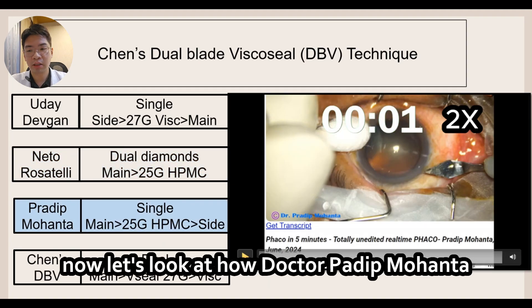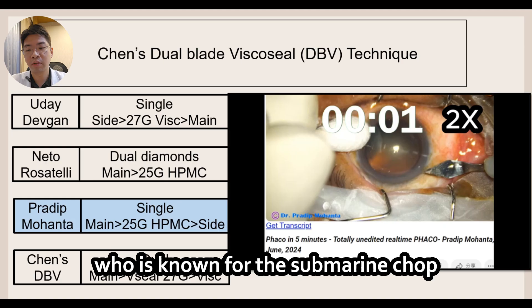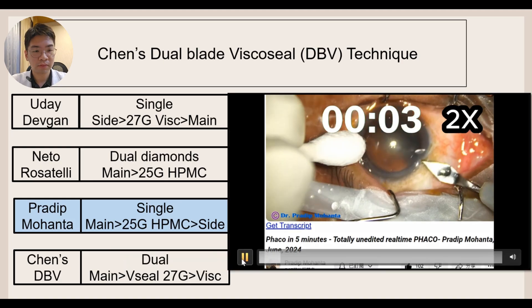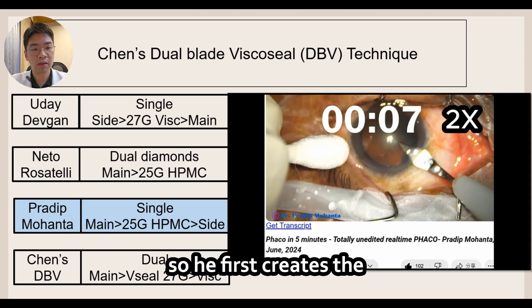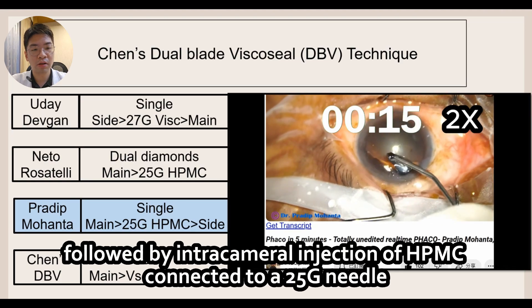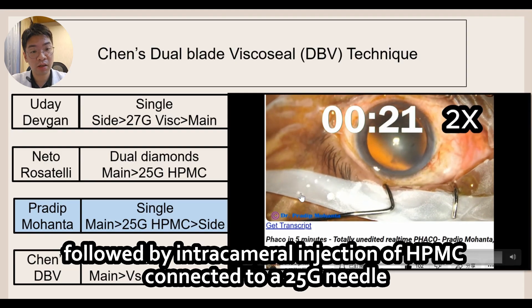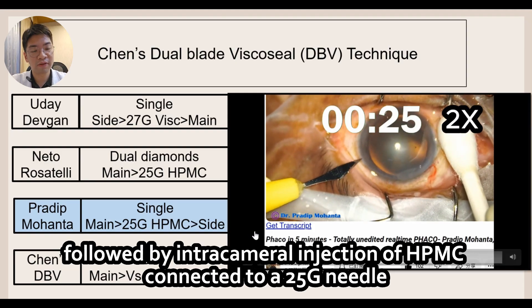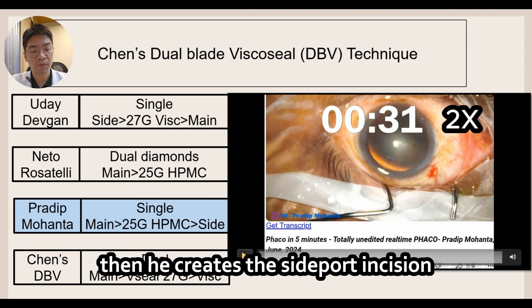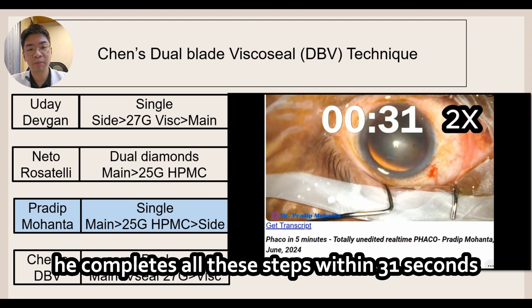Now let's look at how Dr. Pradeep Mohanta, who is known for the submarine chop, performs his cataract incisions. He first creates the main incision with a steel keratome, followed by injection of HPMC connected to a 25 gauge needle, then creates the side port incision. Because he is incredibly fast, he completes all these steps within 31 seconds.